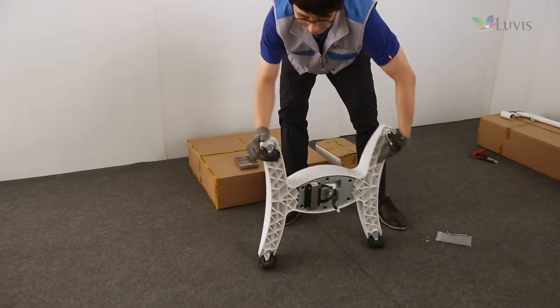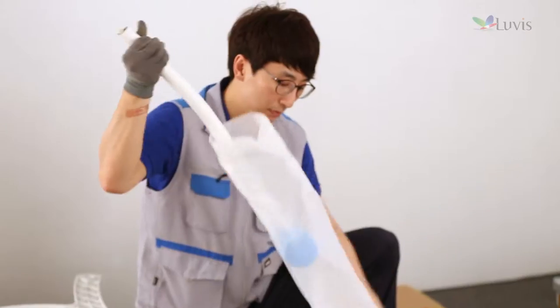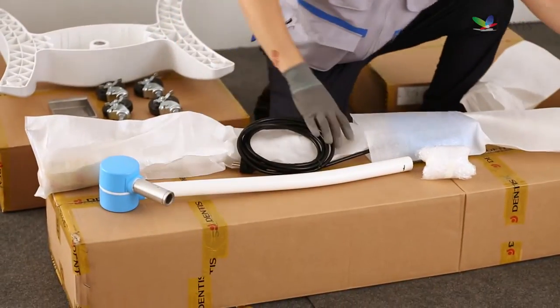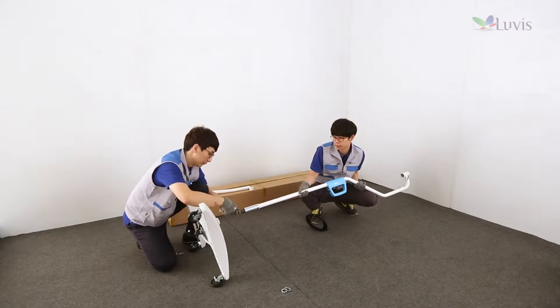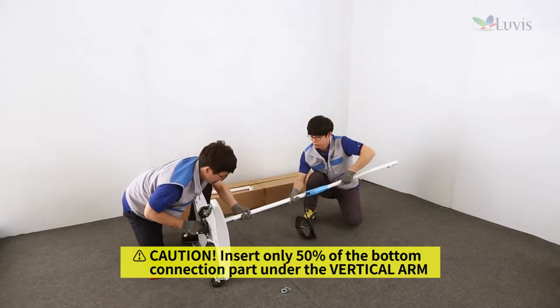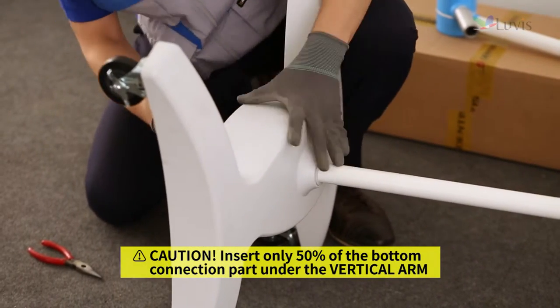Turn over the base body to make the casters face the floor. Open the vertical arm box and check the status. Make the bottom connection part face the base body, aligning the vertical arm with the center hole of the base body. Insert the wire first and then connect the vertical arm to the base body.